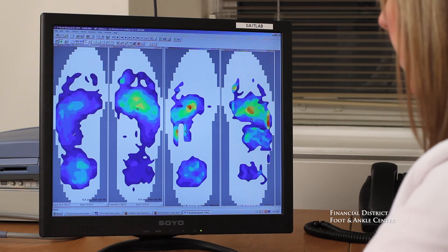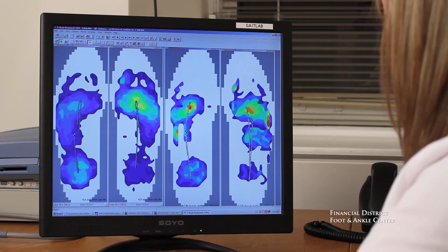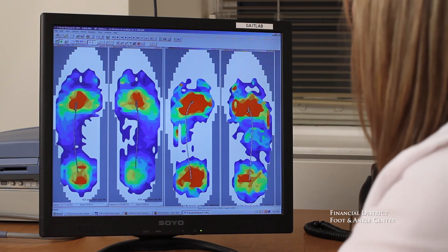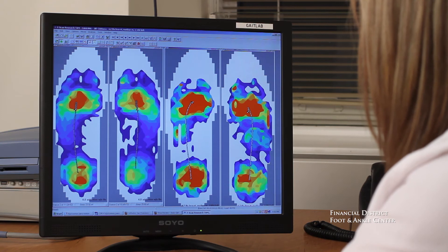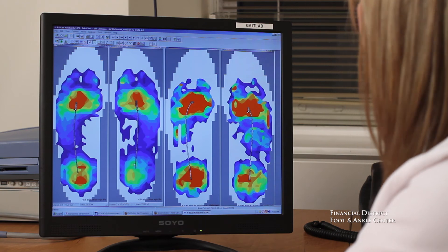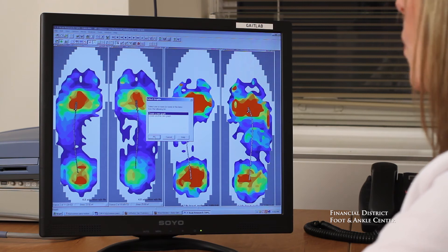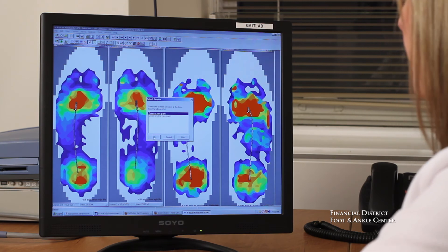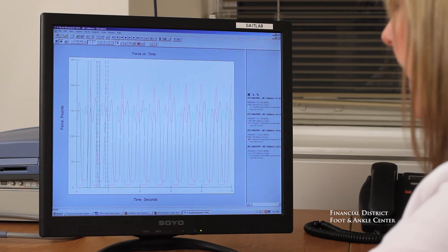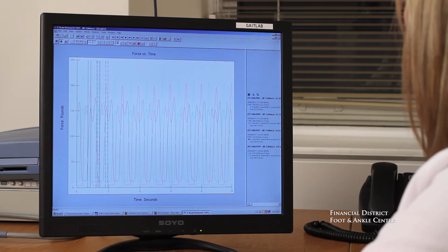The third measure that the F-Scan shows us is trajectory, or the way that the center of force travels through the foot. Here you can see symmetrical, and here you can see not quite symmetrical. The F-Scan also has quite a few different graph systems that can show us right versus left and left versus right, and then we know what a normal value is so we can correct accordingly.